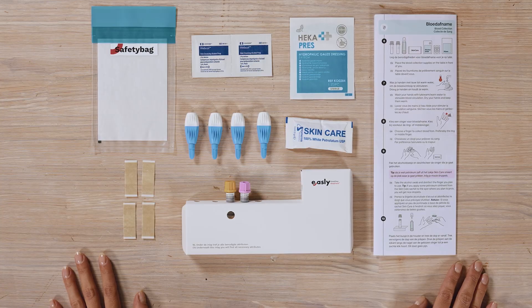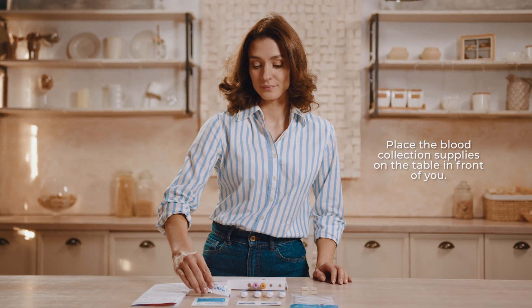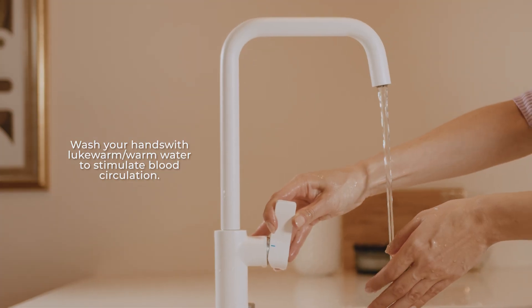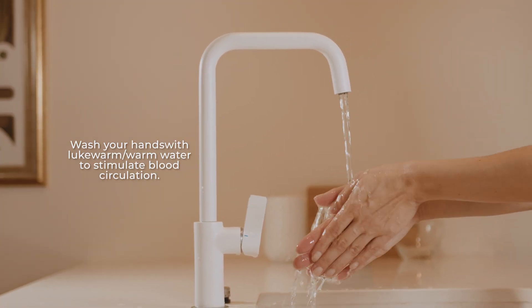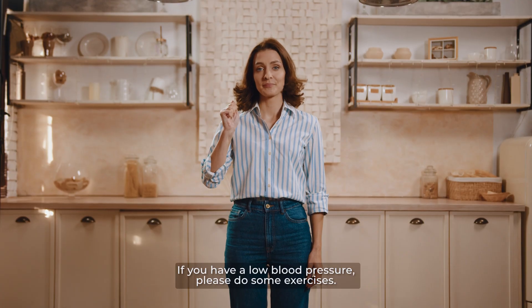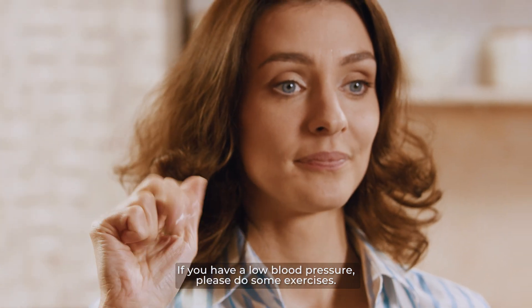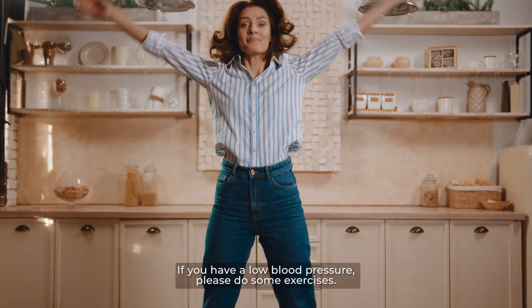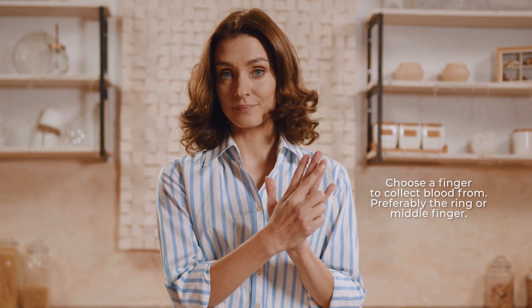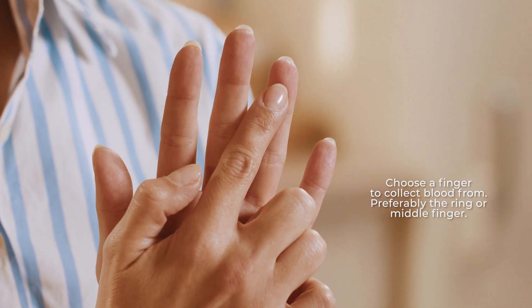Blood collection. Place the blood collection supplies on the table in front of you. Wash your hands with lukewarm or warm water to stimulate blood circulation. Dry your hands and keep them warm. If you have low blood pressure, please do some exercises. Choose a finger to collect blood from — preferably the ring or middle finger.